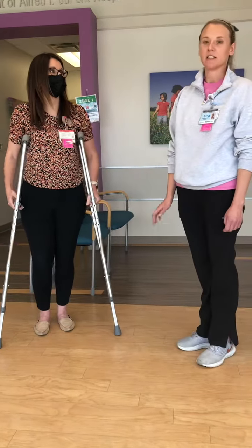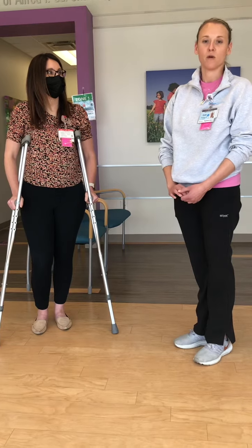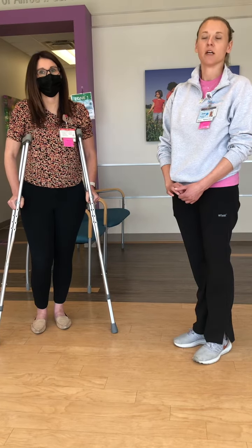If the patient is 10 years of age or younger, you'll want to consult with physical therapy to have them conduct the training.